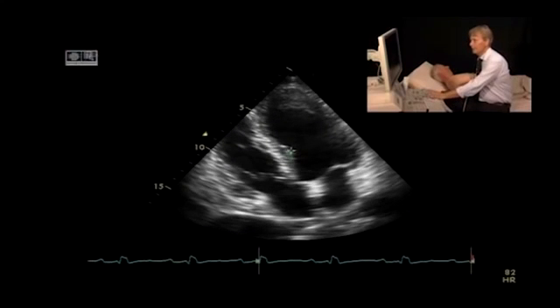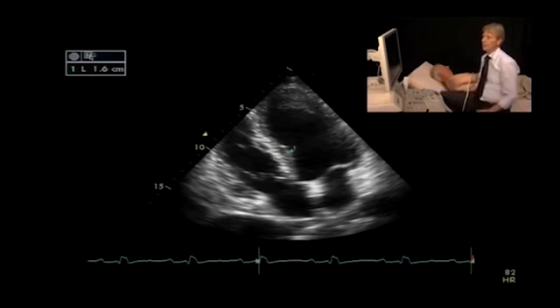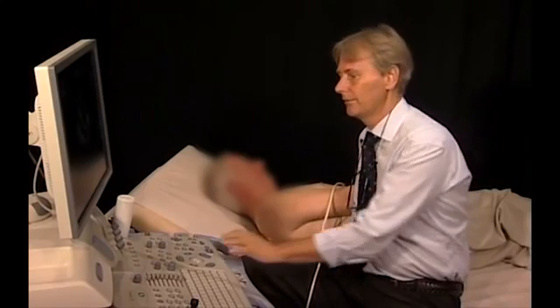Then I perform a measurement of the septum, which I would perform in a region of the septum which is located where you would also measure the M mode. So it's between the mitral valve and the papillary muscle. However, I would avoid measuring the maximal thickness if the patient has prominent mid-ventricular septal hypertrophy. So I would then measure somewhere below or above this region.